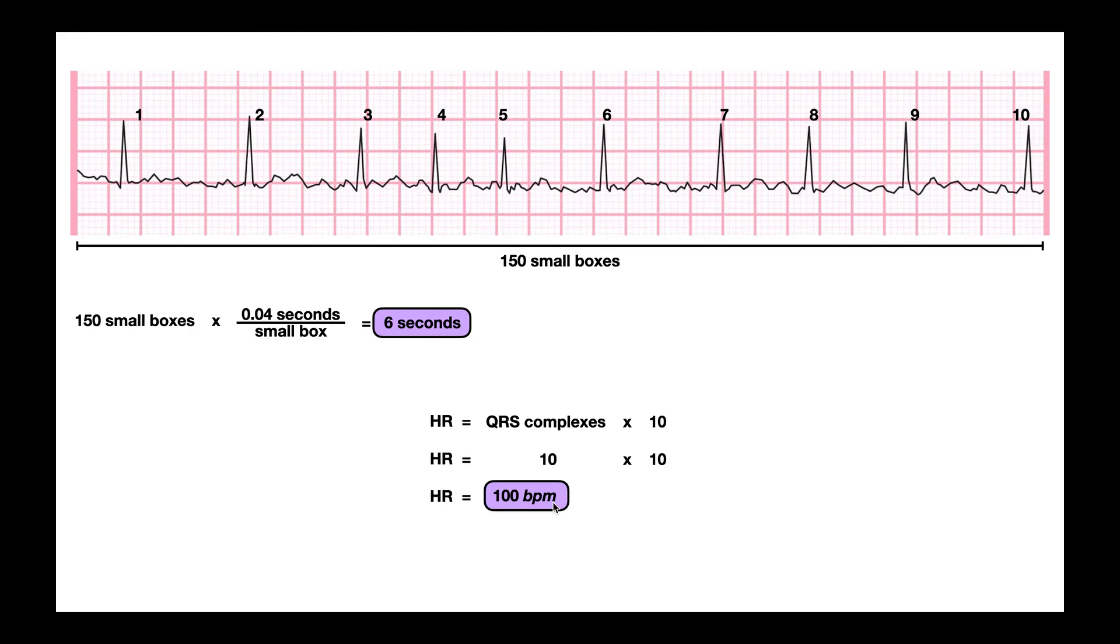Now you'll notice I said average heart rate. Why is it an average? Because each one of these RR intervals is going to have a different heart rate. It's irregular. So I have to take a composite or an average over the course of this entire 6 seconds.